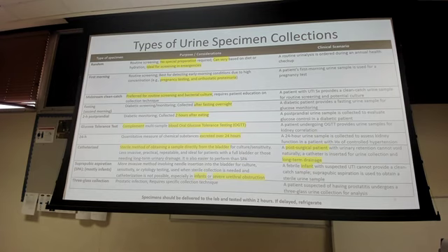And 24-hour is a quantitative measure of chemical substance excreted over a 24-hour period, okay? So when a 24-hour collection is collected, we're not necessarily using that dipstick. We're actually taking it back, running additional studies, more quantitative studies. So make sure you know that one, that 24-hour, okay?